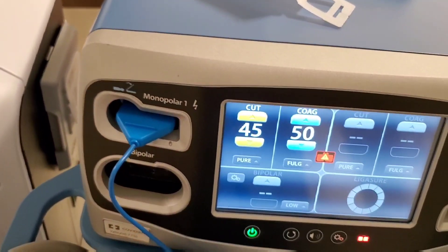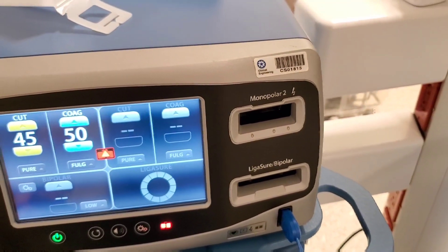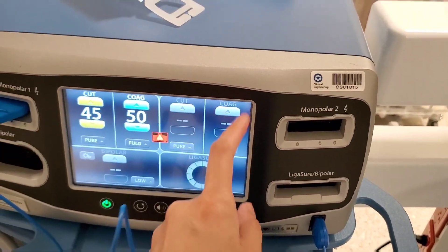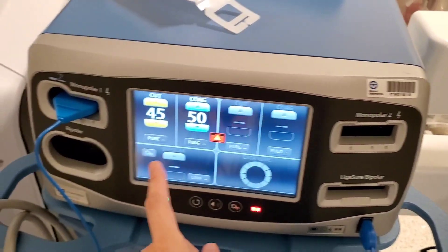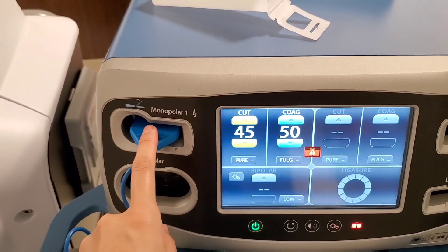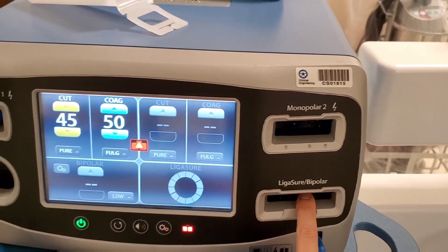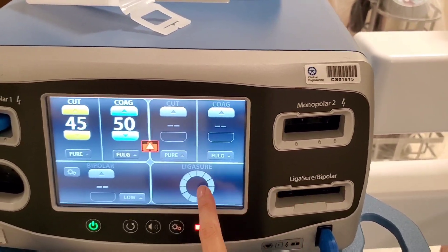It doesn't matter if it's monopolar one or monopolar two — it doesn't. As long as if you plug it into this one, you have to adjust this. Bipolar is not the same as monopolar. This is for like neural stuff, and then this is for the LigaSure, and this is the thing for it.